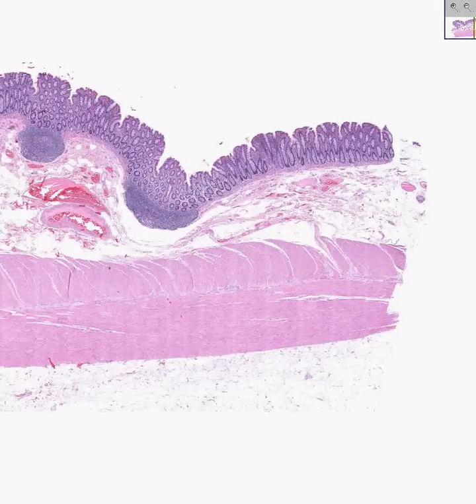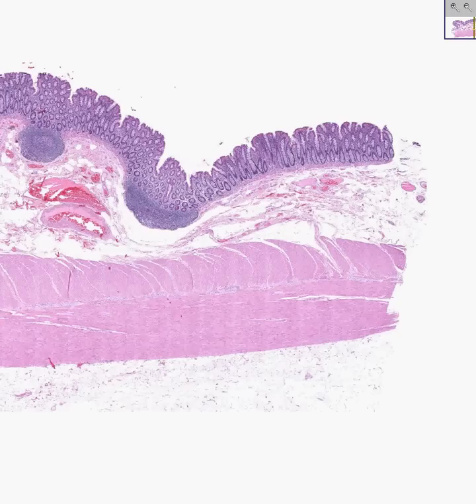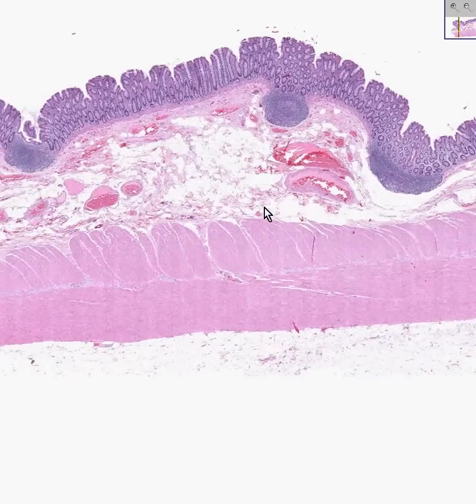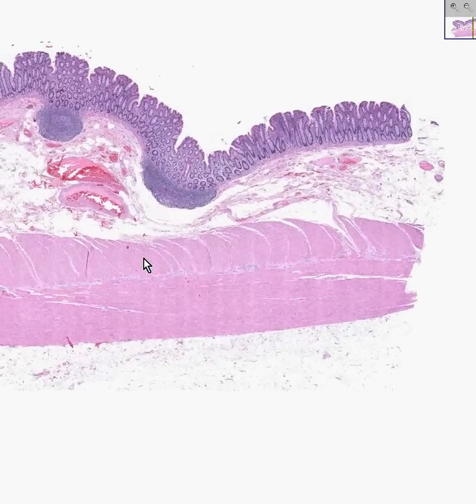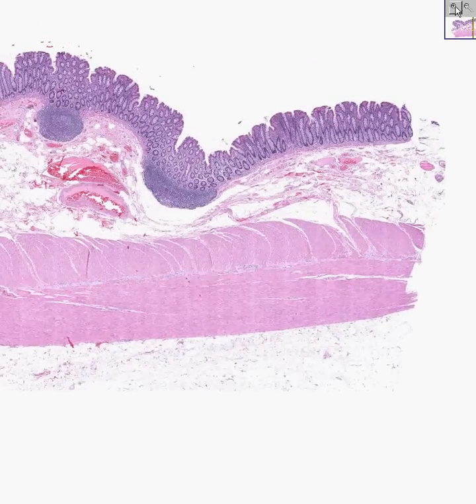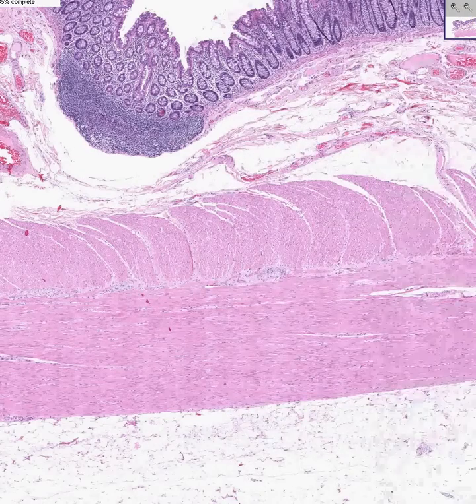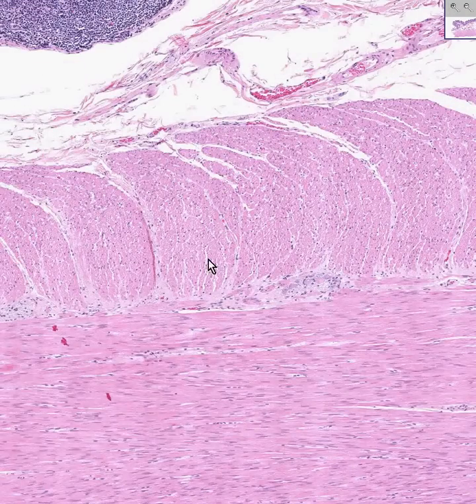The large intestine, or colon, is quite simply the prototype or mother of all classical GI histology models because it has all four layers, and it has them nicely and classically. Note that this was probably a piece of colon or large bowel which was cut longitudinally with respect to its axis rather than cross-section, because the inner circular muscle fibers look like they have round nuclei, and the longitudinal look like they're rather spindly.